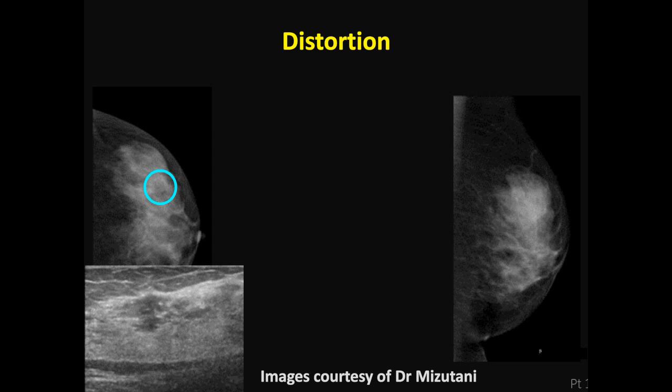We are fortunate in that on the floor above us, we do MRI, PET, and CT, so we have a large number of nurses who start IVs. So when we first started, we were able to get them to come downstairs and help us. We are now doing so many contrast mammo studies that we have actually added a department nurse who can help us both with doing the IVs as well as helping us with our large biopsy population. So you do need to get some ancillary help to get the IV started. Once the patient has the contrast, the study itself is quick.